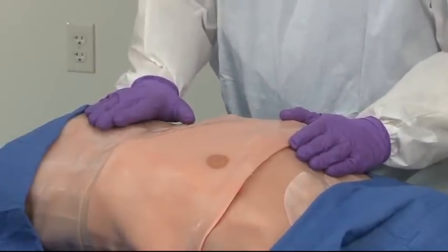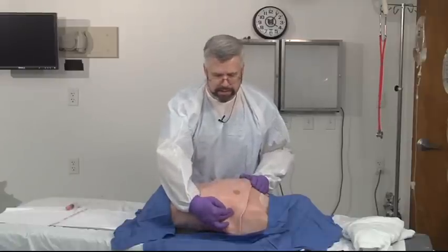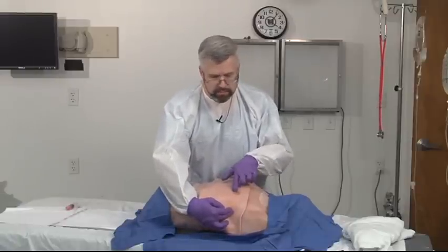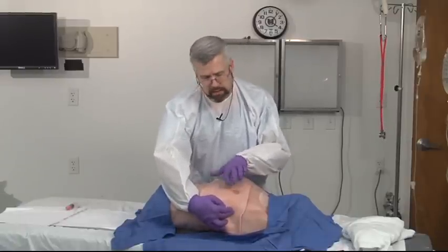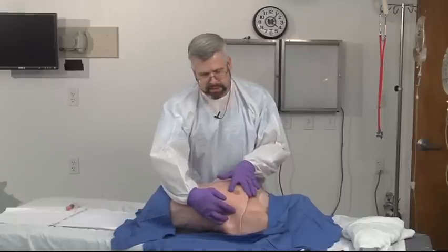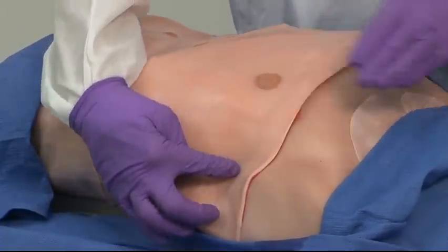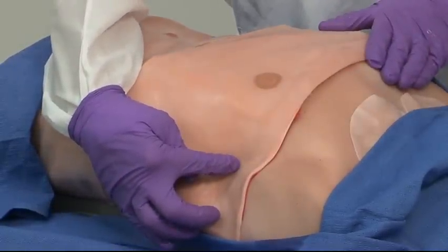Once again, if you recall, the landmarks for the chest tube are going to be the 4th or 5th intercostal space. And we use in the male the nipple, or in the female the inframammary crease. And in patients in whom this anatomy is a little bit distorted, you can also take your hand and put it in the axilla, and the bottom of your hand is about the 4th or 5th intercostal space.